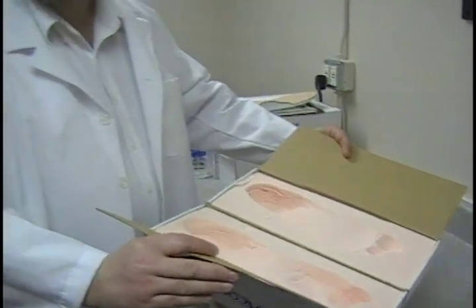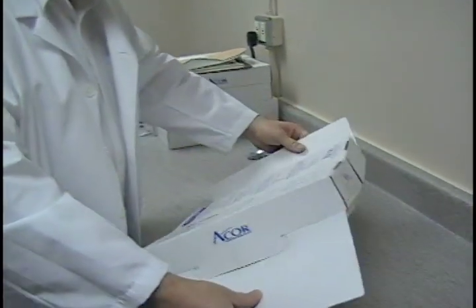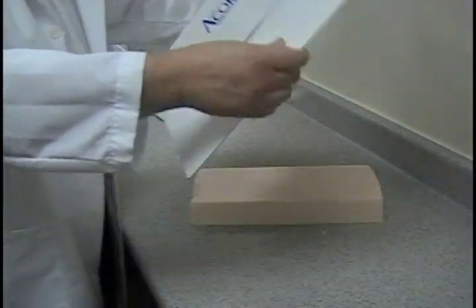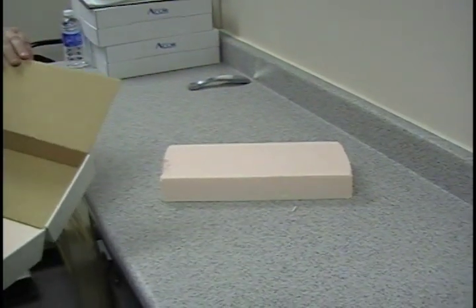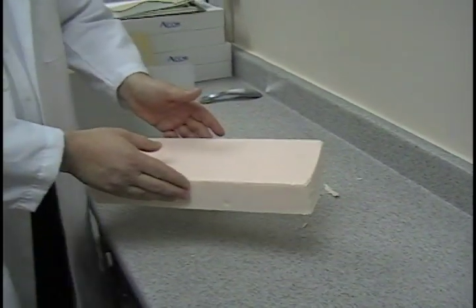Once you've got your impression taken, we need to take the foam out of the box to put it into the scanner. It's pretty simple to do. Just on a flat surface, turn it upside down. You want to lightly grab the tabs here and just shake it — give a couple shakes and you'll see it very easily and quickly comes out. And that's your foam ready to put into the scanner.